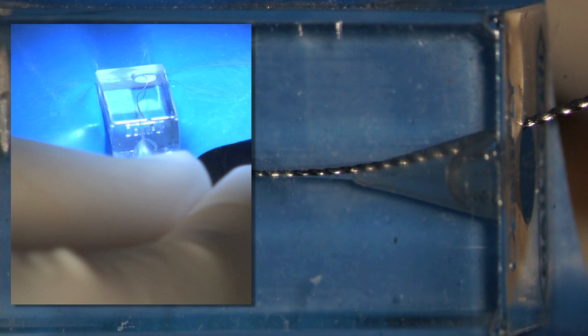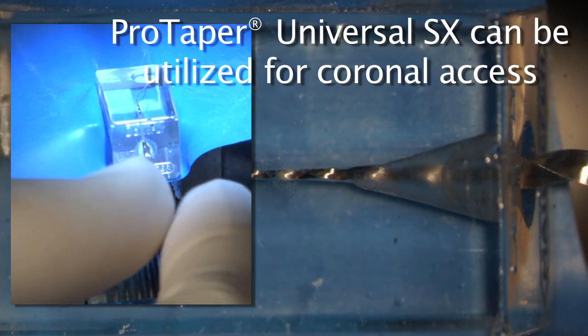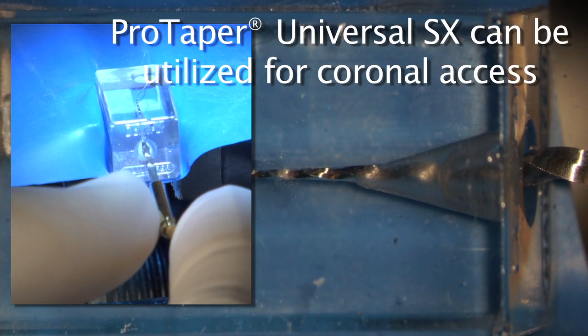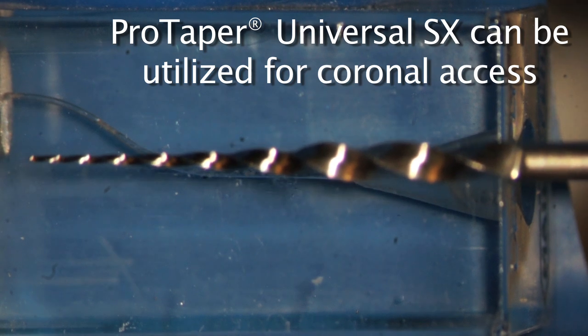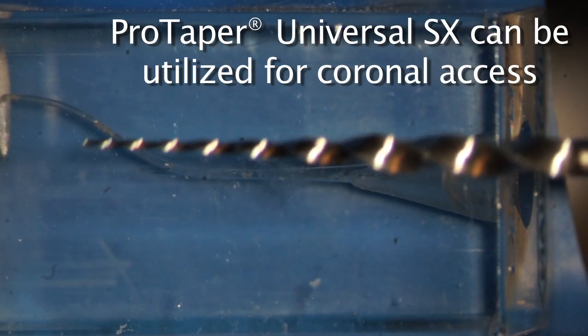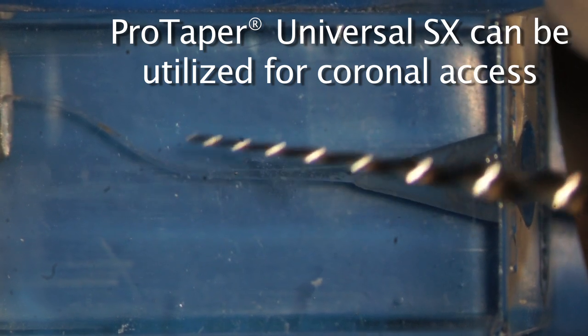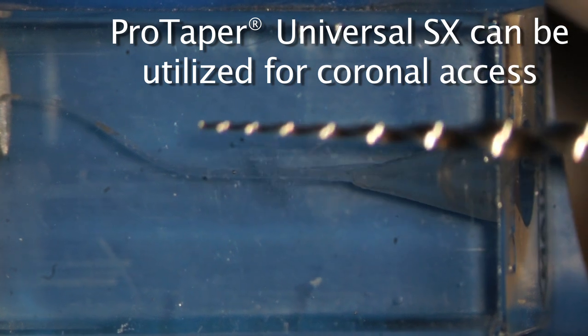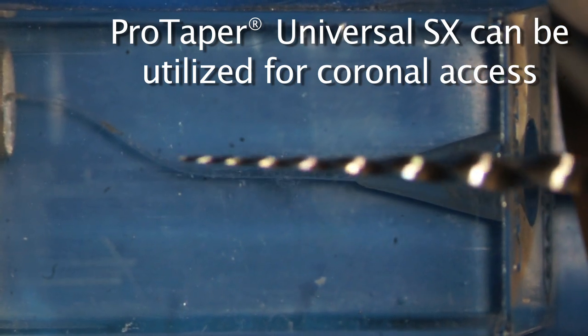The SX is a great instrument to rapidly pre-flare the orifice. It can remove triangles of dentin, and also it can relocate the coronal aspect of canals away from external root concavities. The SX has the biggest taper in the business, it's 19%, and right in the middle of this instrument is a GG1234. So we can use this in a brushing motion. I really want to emphasize brushing, so that it doesn't grab. If your SX is grabbing, you're pecking, and you're not brushing.